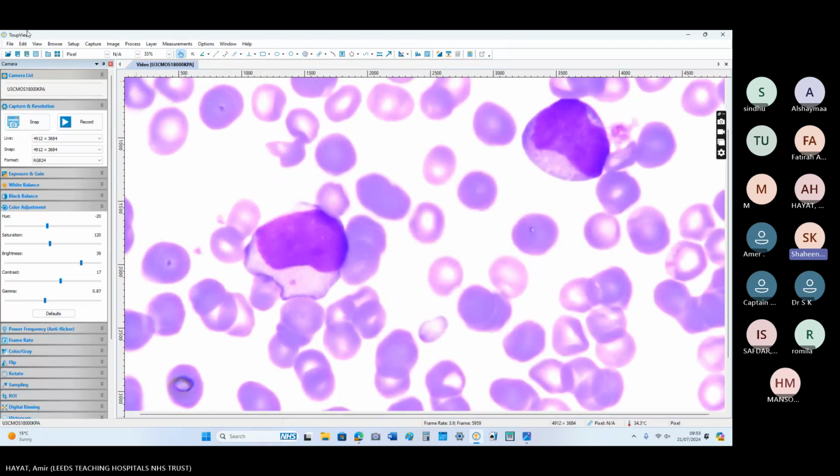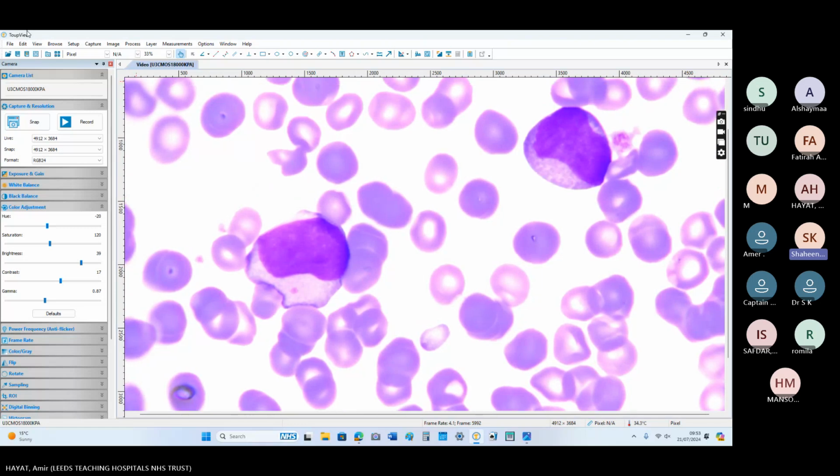I can see mononuclear cells increase in number, and these are medium to large in size, and they have an irregular nucleus with open chromatin. Some of the nuclei showing prominent nucleoli as well, whereas the cytoplasm is moderate or adequate. Most of the cells showing agranular cytoplasm, but there are some inclusions I can appreciate in the granulocyte, but frank Auer rods I cannot appreciate.